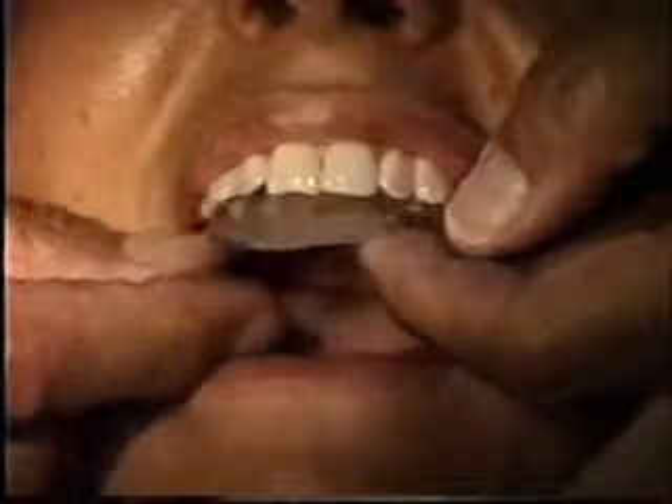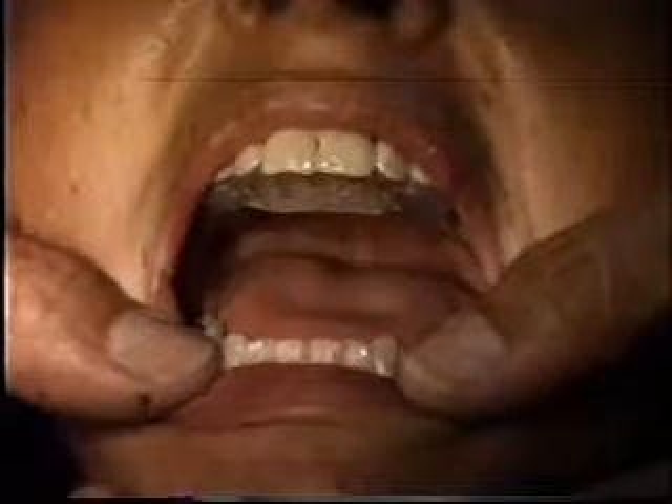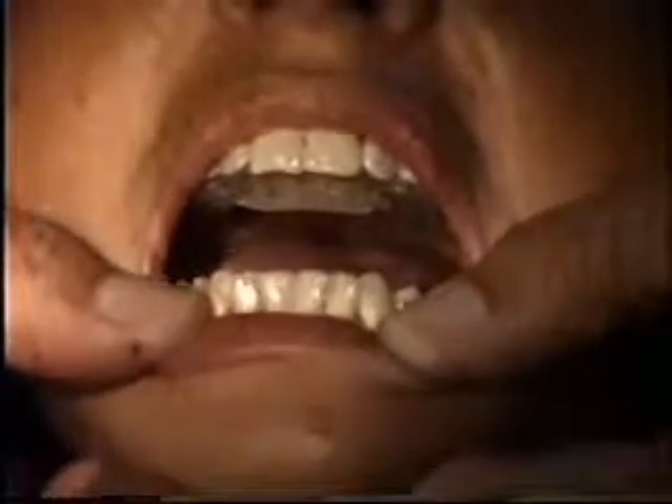At this time we will rebase the bicuspid areas so that when she closes in, she will close right into that new position, and that will be giving her the guidance instead of the anterior ramp.